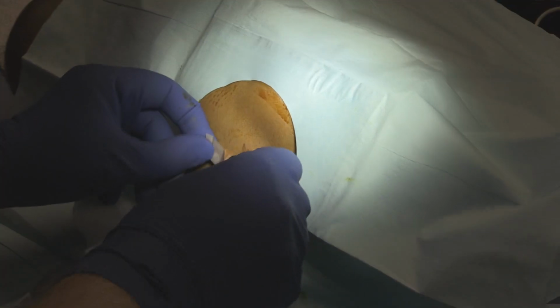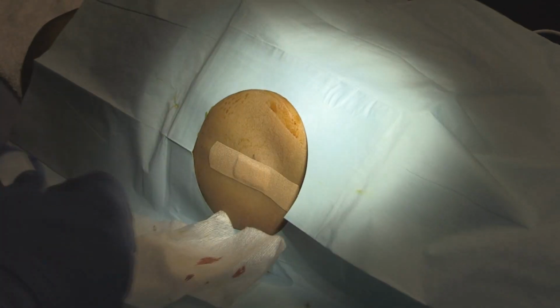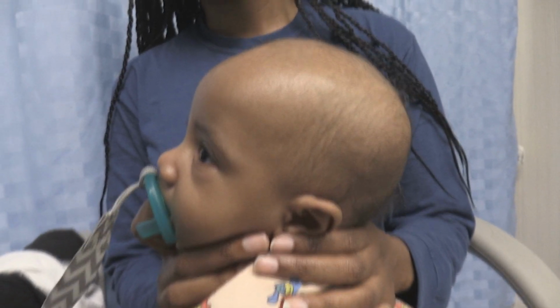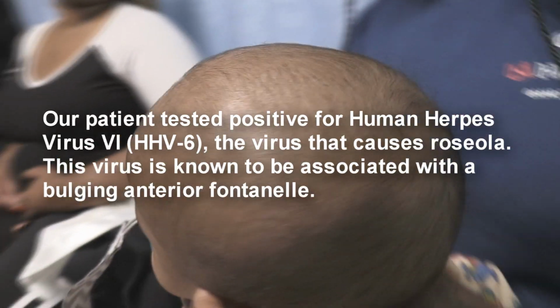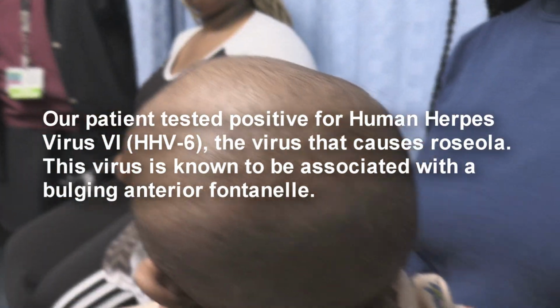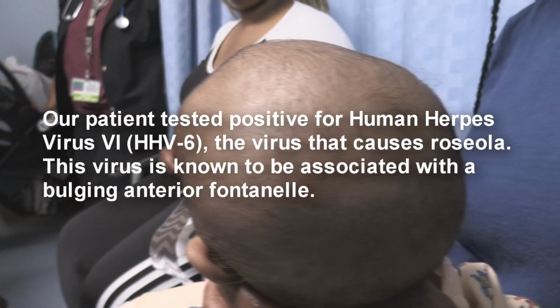Okay. So out comes the needle. This little one had the bulging fontanelle and the fever, and that's why he got the spinal tap. So, Mom, thank you for letting us do this video, and you're okay if it's on YouTube and all that stuff. Yeah. Okay.